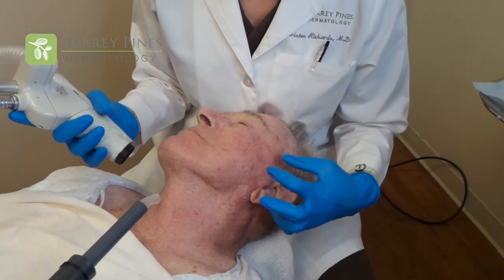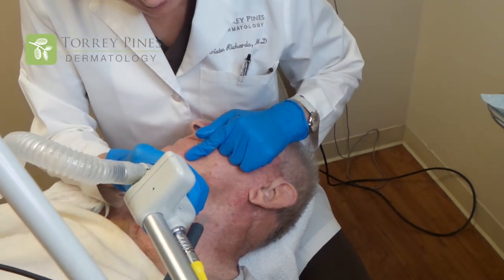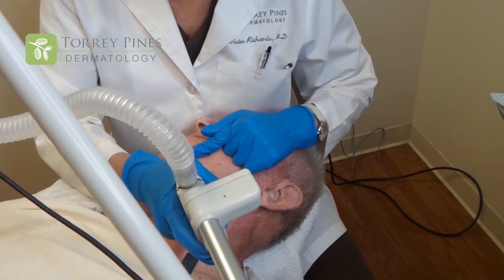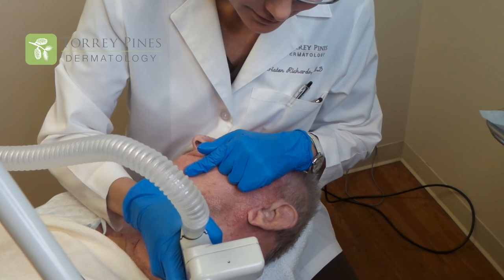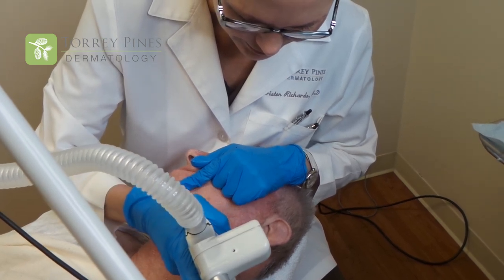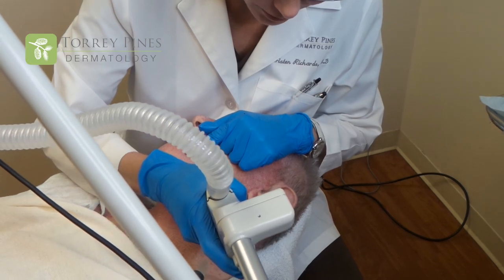We're finishing up the Active FX procedure. You can see all these little white dots created on his face and neck from the laser beams destroying the sun damage. We're finishing up his neck now. You can see the grid pattern as we go, which tells us we're tracing along the lines and getting rid of all the sun damage. Areas with redness tend to heat up a little bit more, and there's a lot more sun damage where it's red and brown, so the laser takes full advantage of that to clear the area and regenerate brand new fresh skin cells.